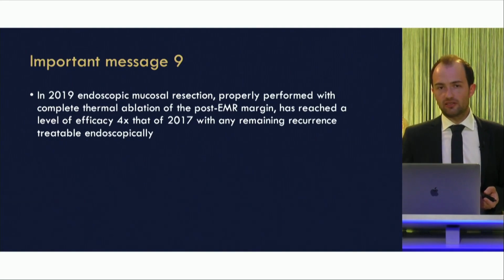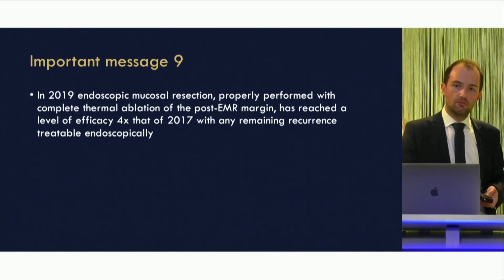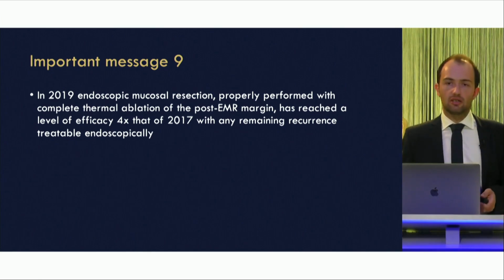So what is the last important message? Well, I think endoscopic mucosal resection properly performed with complete thermal ablation of the post-EMR margin is 4 times as efficacious as it was 2 years ago, and any remaining recurrence can be treated endoscopically.